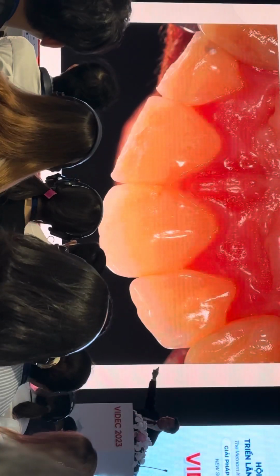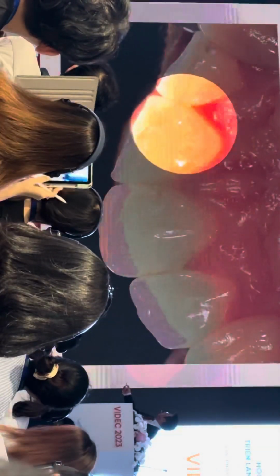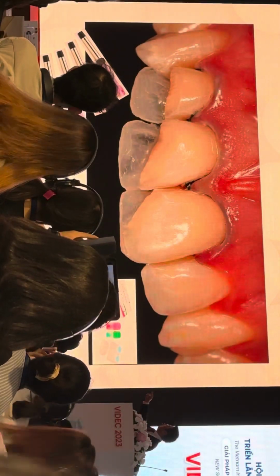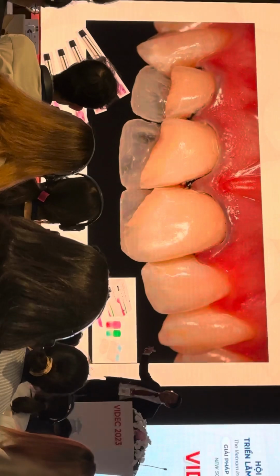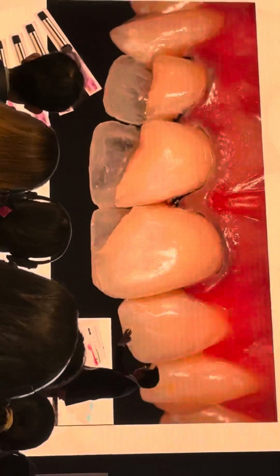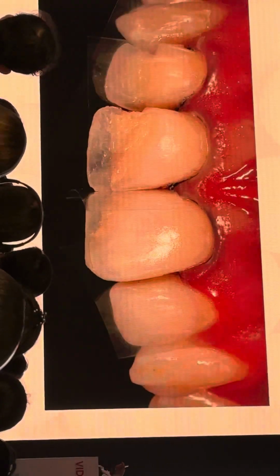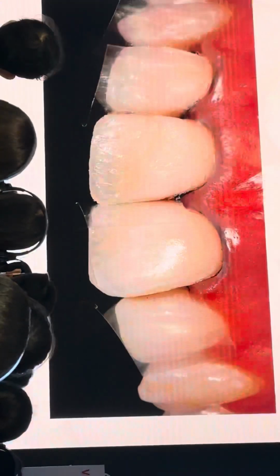we also, on the palatal surface, okay, we etch this area, and we extend bonding, and we extend composite also, okay. We place the first layer. Actually, this technique was with the mock-up technique. Okay, I didn't put the silicone key picture, but this was with the silicone key. We make the first layer with composite, and like here, and next layer composite, next layer, layer by layer, okay, and polish and it looks high aesthetic.